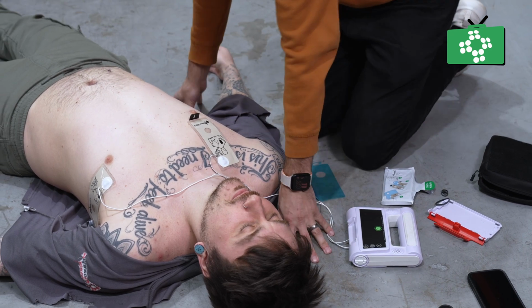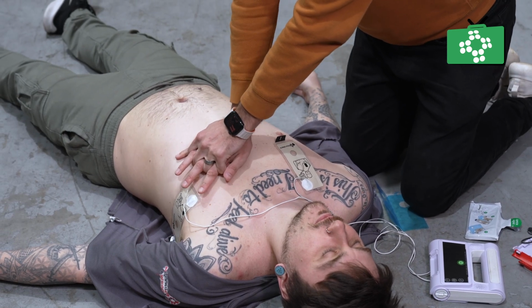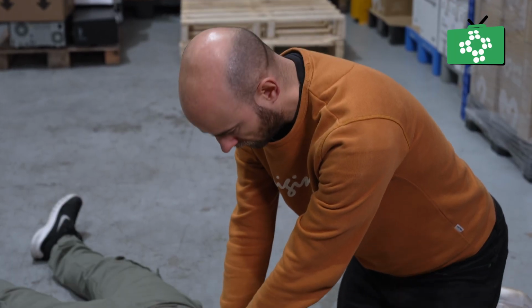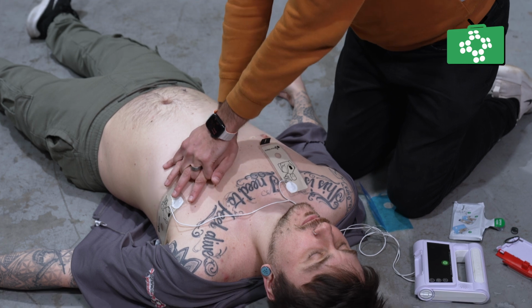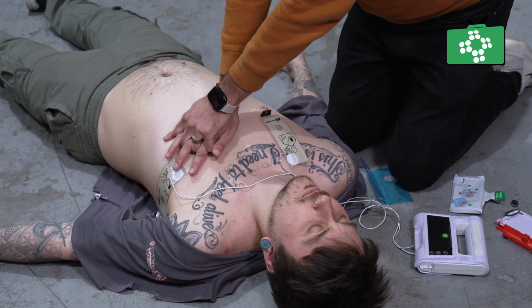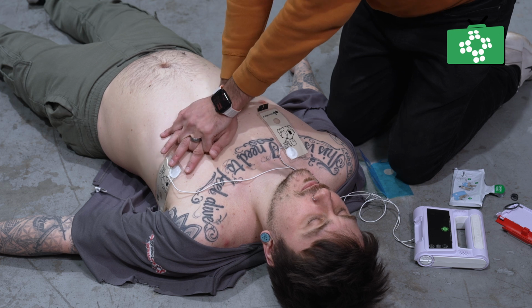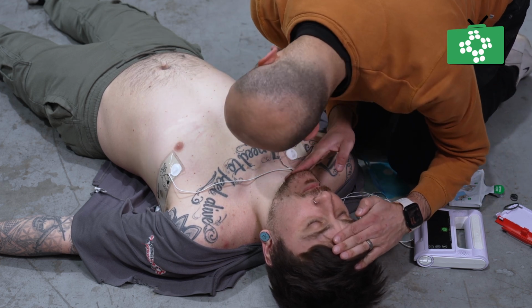However, not every cardiac arrest rhythm can be treated with a shock. In some cases, the AED may analyze the heart rhythm and announce that no shock is advised. This does not mean that the device is malfunctioning. It simply means that the detected heart rhythm cannot be corrected with defibrillation. In these cases, continuing high-quality CPR is the most important action.